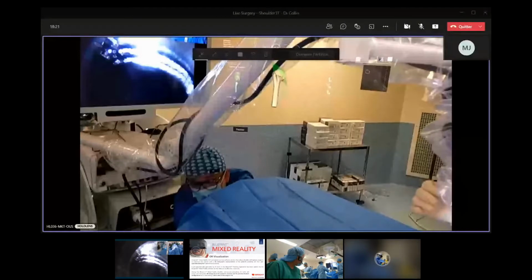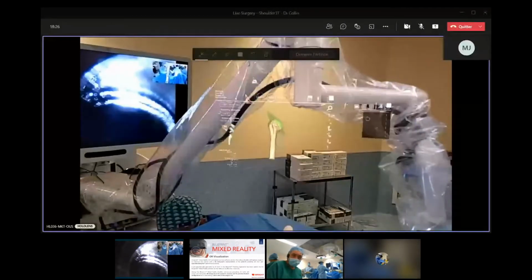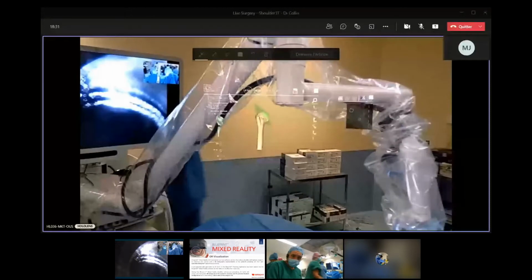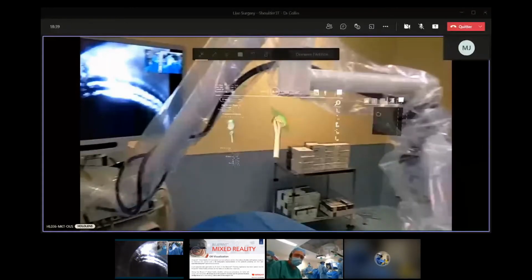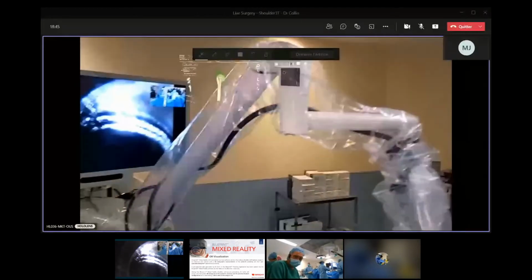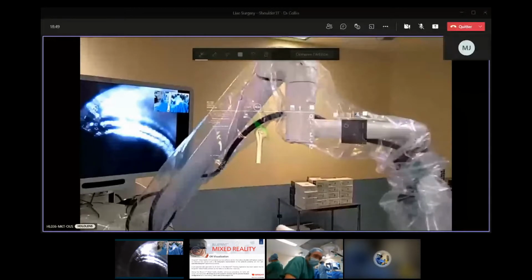So do you see the planification here? Yes. So that's what we call head-up display. This is the principle of this technology. Of course, I cannot continue without thanking Maya and Isabel. I'm sorry for that. So this is the device, and you see it's a head-up display.